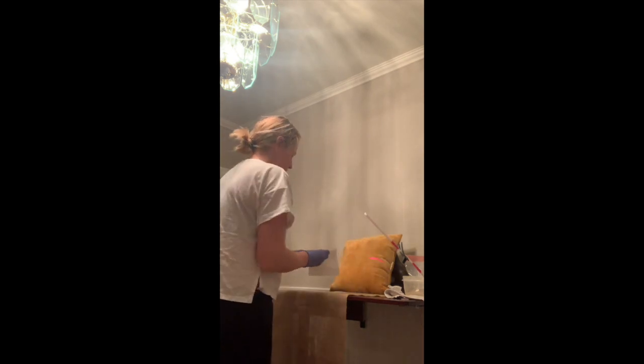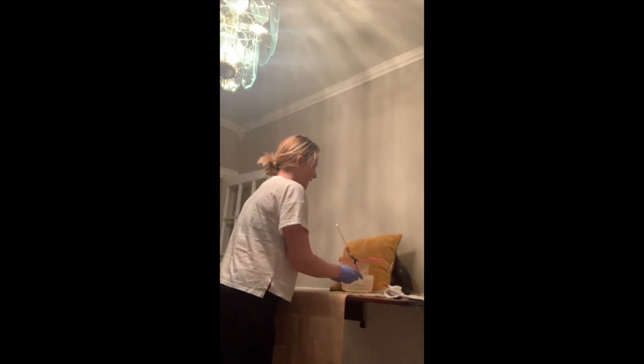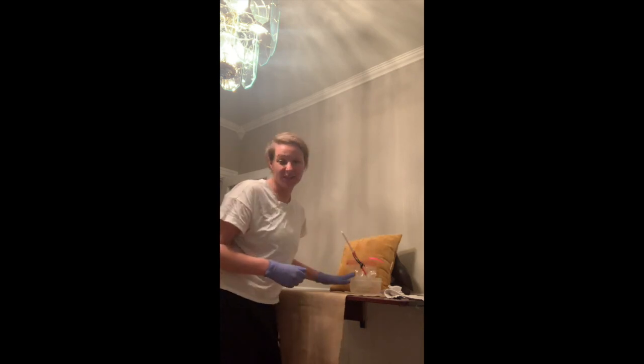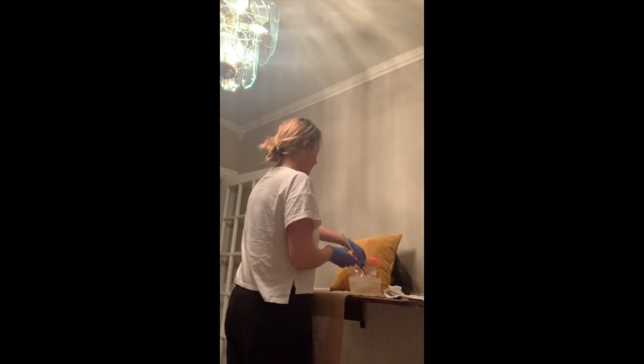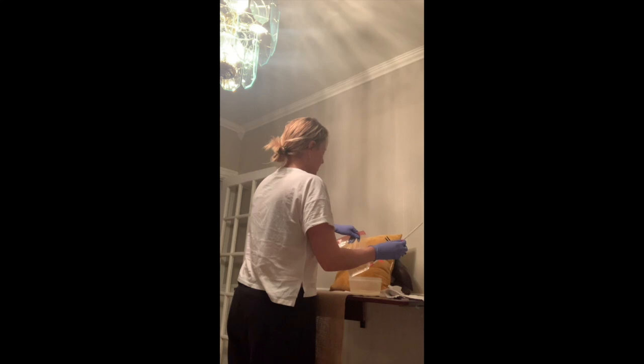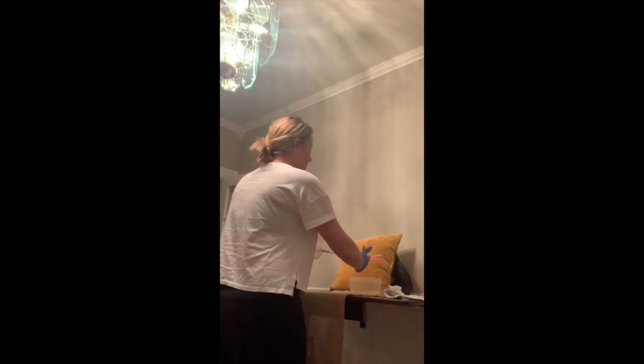I'm going to pad the patient's bed so that way this doesn't get everywhere. I padded the bed. I'm going to take my bag and leave this plastic container here, just because I don't want the water getting all over. I'm going to insert the tube — it's already lubricated — and I'm going to go towards the umbilicus.